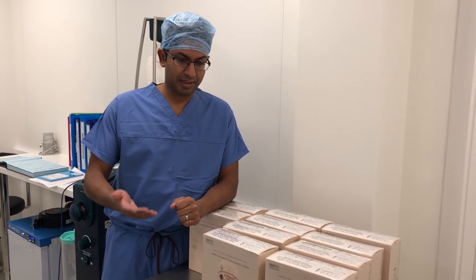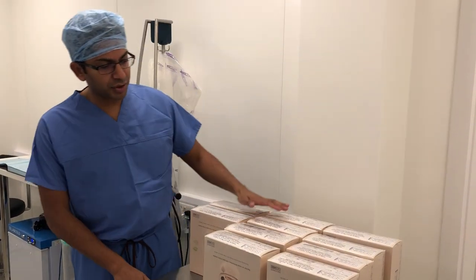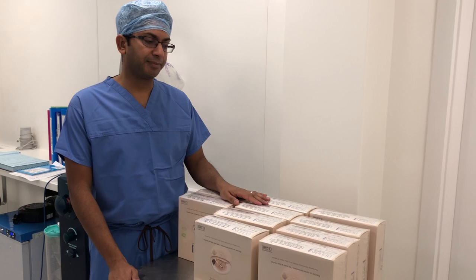She's come back here to the clinic to have a breast enlargement with implants, and as you can see I've got a range of implant sizes available for her.